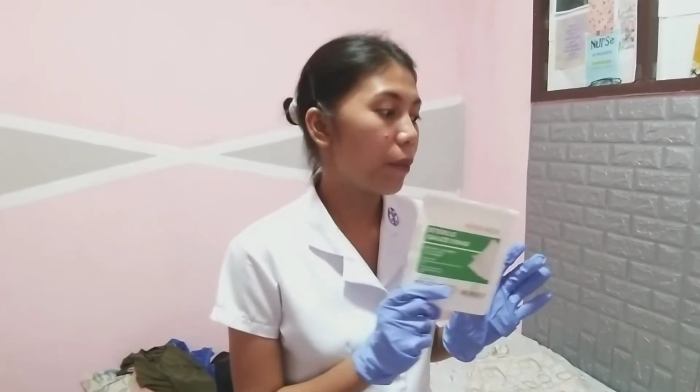So using this sterile gauze swab, we can pad the tubing and band over the ears and cheekbones if needed. This is to prevent irritations because friction may happen on that area, like in the ears or in the cheeks, in any minute. So we can prevent or avoid that to cause irritations.